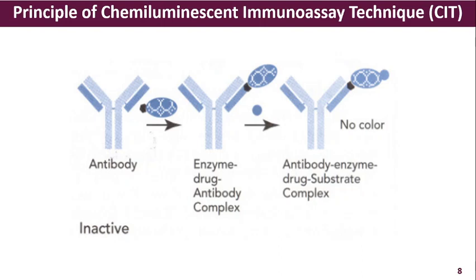With the result, the FAB sites of the antibody molecules will be occupied by the drug enzyme complex, and it will not be available to react with adamantyl dioxetane phosphate. Therefore, there will be no luminescence.